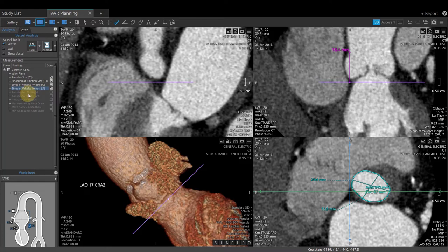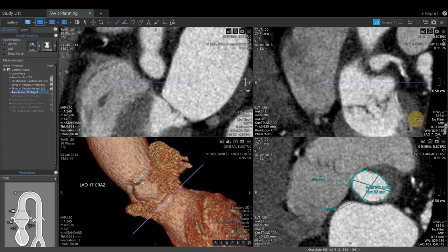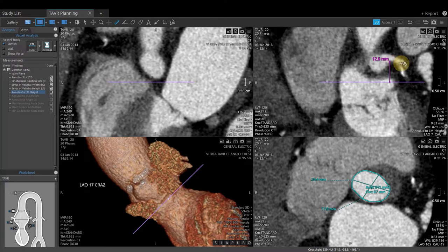The next measurement is the annulus to left main height. Left-click to activate. Roll the center wheel to navigate to the ostia of the left main. When the ostia of the left main is visualized, left-click at that point and the software will automatically drop the ruler tool down to the annulus. Edit as needed by clicking and dragging, then click Done to lock this in.